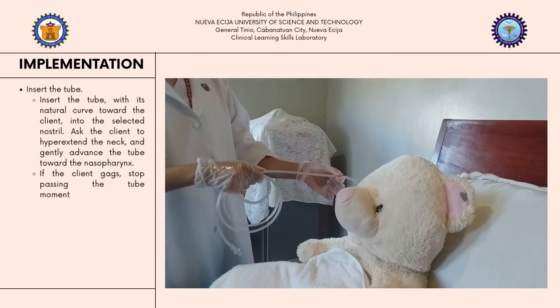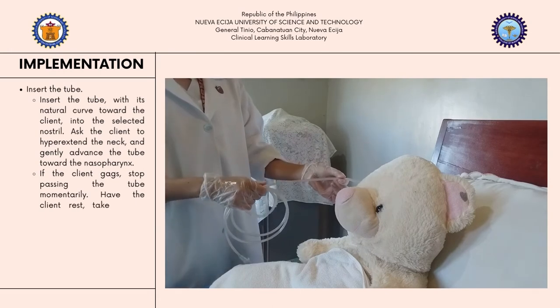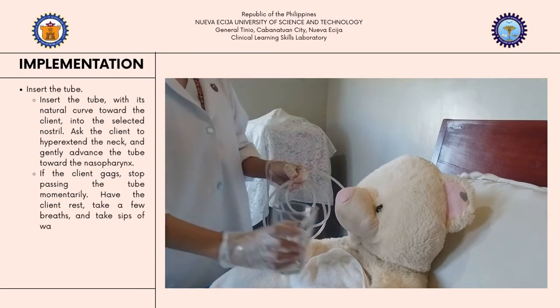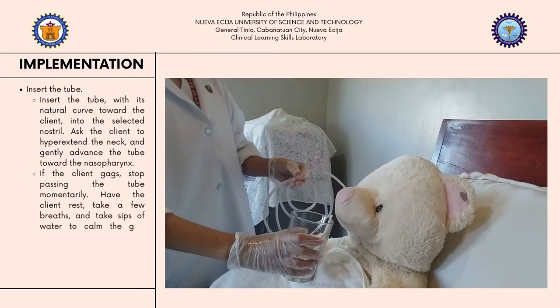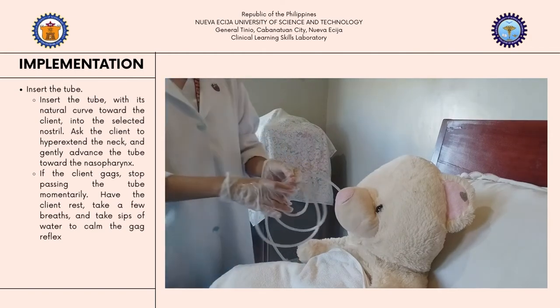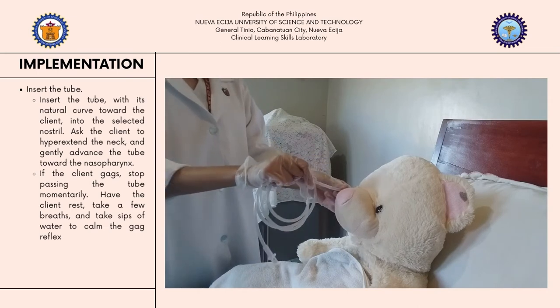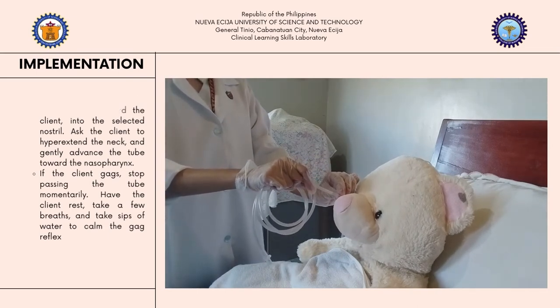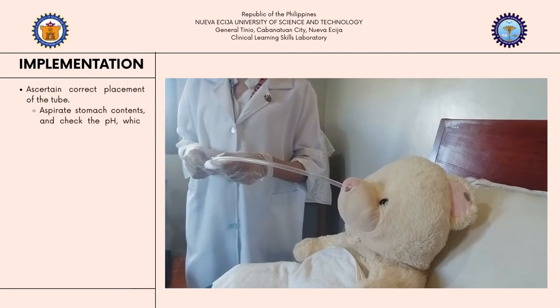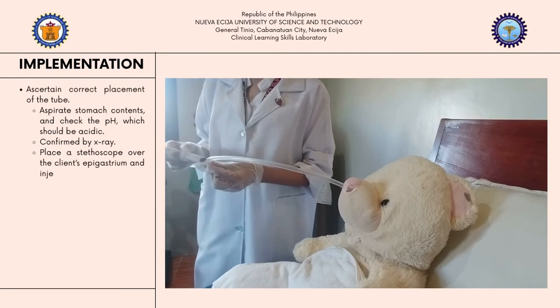But if the client gags, stop passing the tube momentarily, have the client take a rest, and take a few breaths and a sip of water to calm the gag reflex. Then, resume. And now we have reached our marking. To ascertain the correct placement of the tube, we can aspirate the stomach contents and check the pH, which should be acidic.